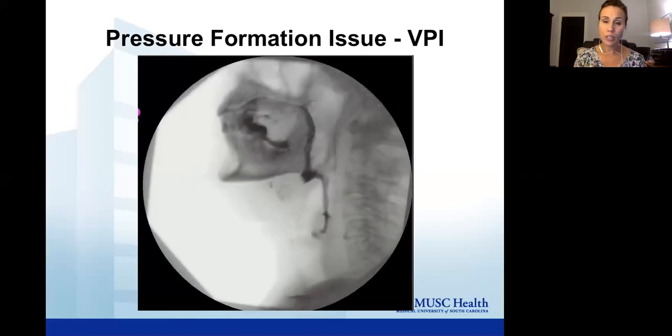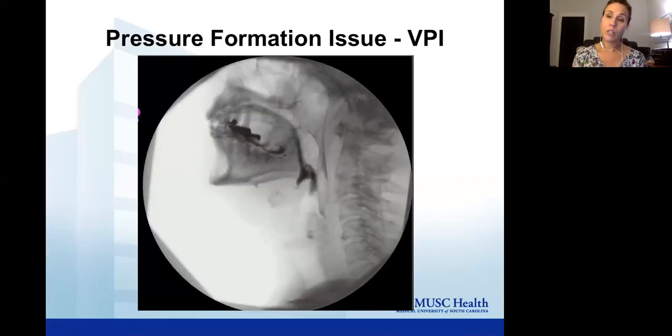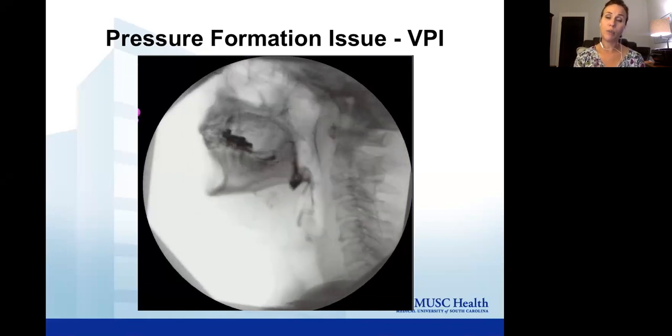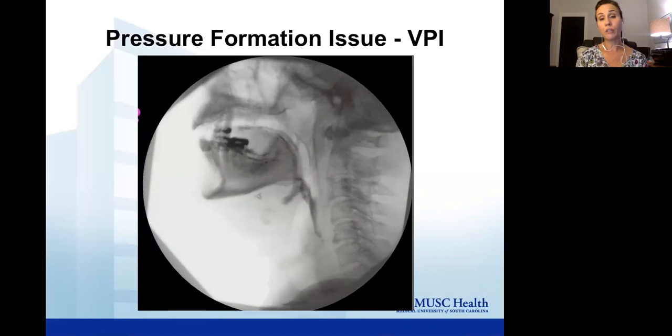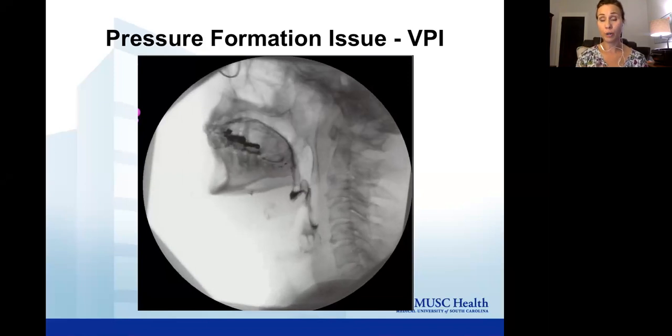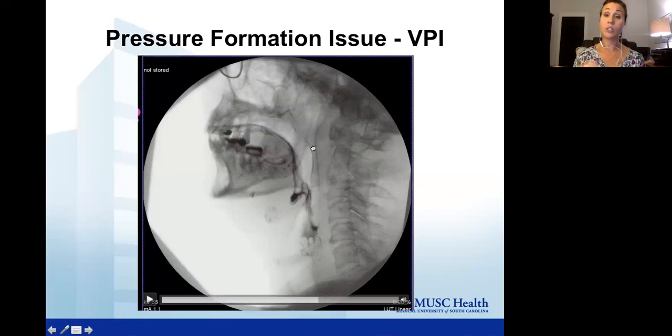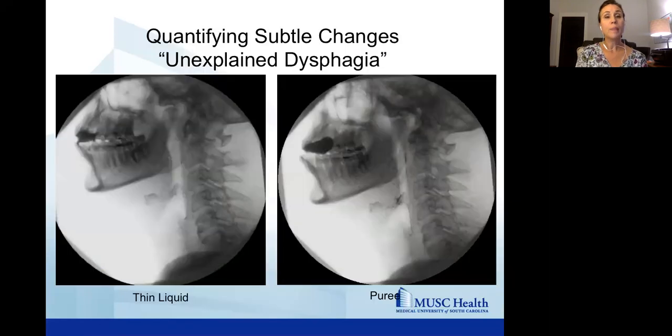So as surgeons, could we start looking more at areas where patients may have these kinds of deficits and be focusing more on surgical interventions to recreate more of a pressure chamber situation? This goes not only with velopharyngeal issues, but also issues such as the glottis, which we already address from an airway standpoint, but also looking at it more from a fluid mechanics bolus propulsion avenue as well.